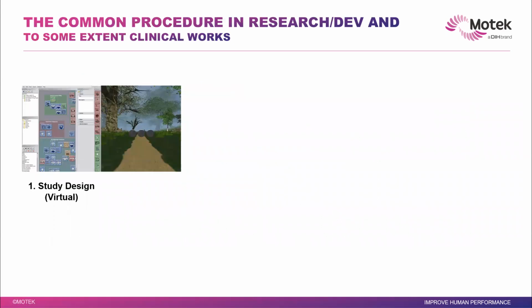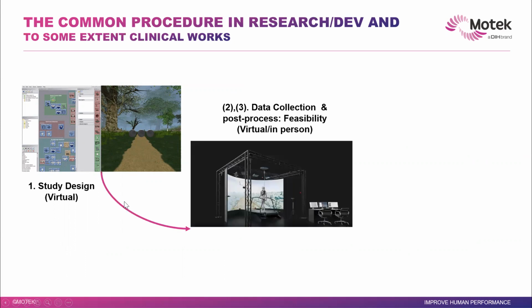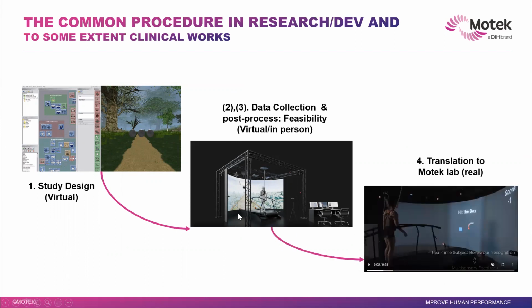Usually the way things work in research and development, this is one way we look at it, is that we study design, talk to colleagues, read the literature, and then collect data, which would be a feasibility study or preliminary study. If that's okay, then you take it to, for instance, the lab or a real experiment.